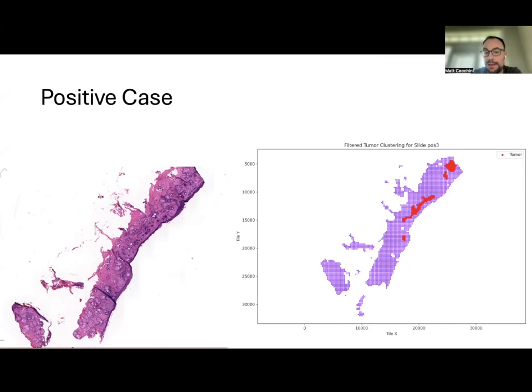This is just an example of an algorithm here that detects basal cell carcinoma in frozen sections that we're currently deploying. As an exciting example of proof of principle, that's something that's relatively easy to do, and just to show that these things are going to be exponentially integrating into our clinical practice.